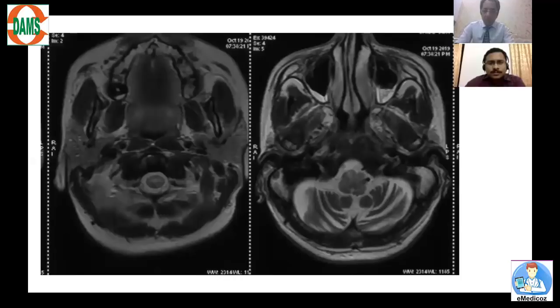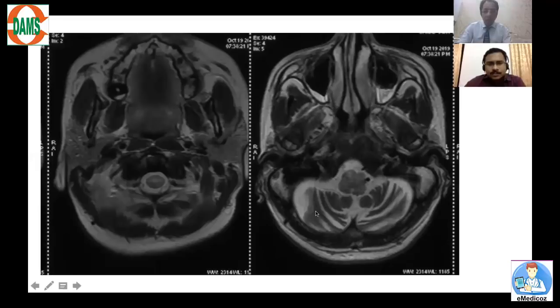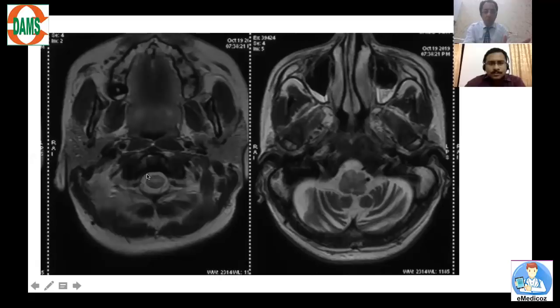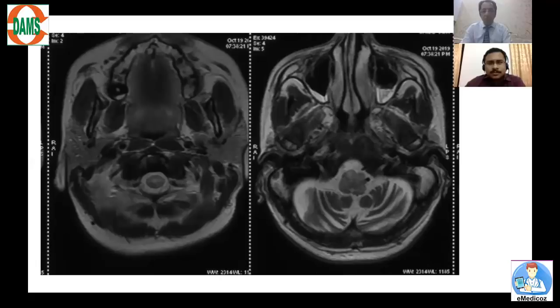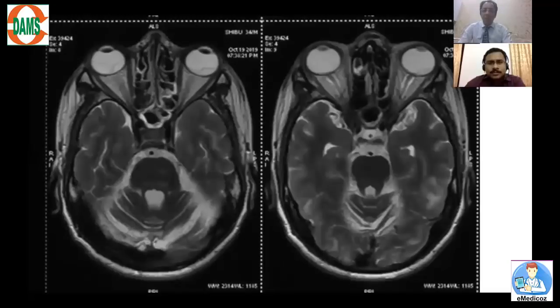Cerebellar atrophy with foliar prominence is confirmed on MRI, correlated with the alcoholic history. An interesting new finding: there is T2 hyperintensity in the medulla — areas of edema. Furthermore, looking at the cervical spine on MRI, there is hyperintensity in the spinal cord also — something impossible to pick up on CT due to beam-hardening artifact in the posterior fossa. This reveals brainstem and spinal involvement, which CT had missed.